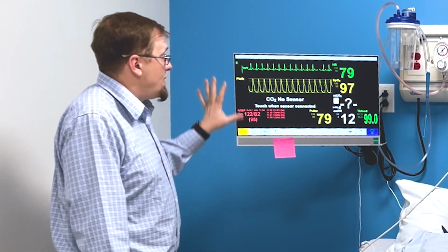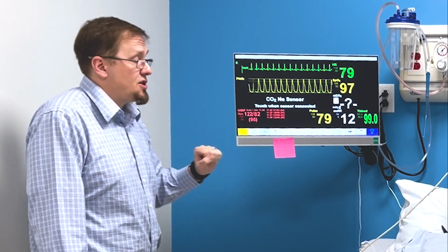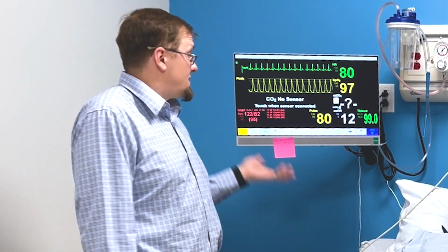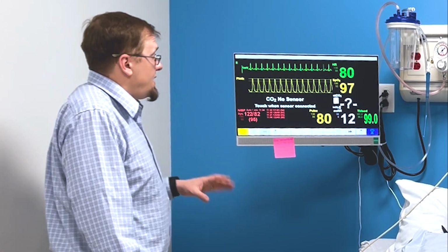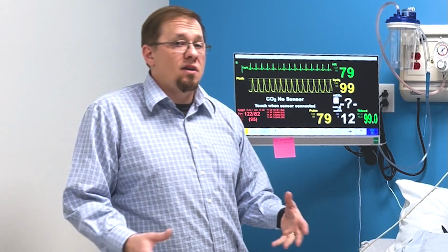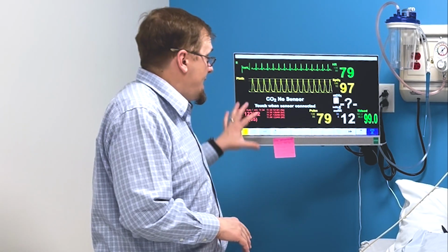From that point over, I try to always put a blood pressure cuff up here that automatically cycles every 1 minute. Now, some people like to have manual blood pressures taken in their sims. That's fine, you don't have to have this. I just think it's not a good time to teach them or test them on taking manual blood pressure, because most times in clinical practice, they're using an automatic cuff. And then I usually have this cycling every minute because that gives them a trend. They're nervous, they're scared, they're not going to cycle it as often, but we want to give them those clinical cues that we might have a change off of baseline, and so that works.